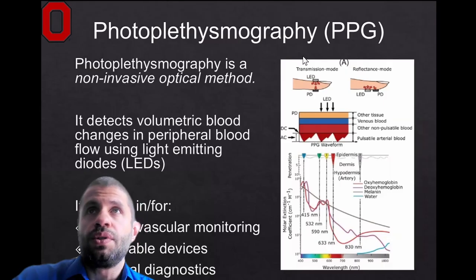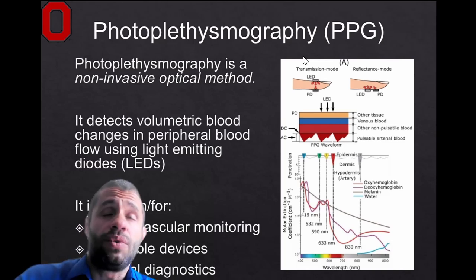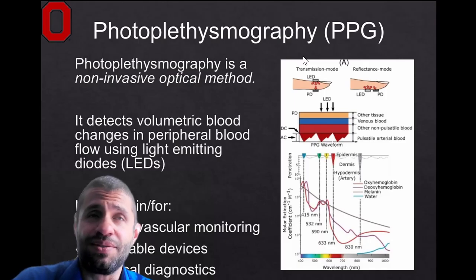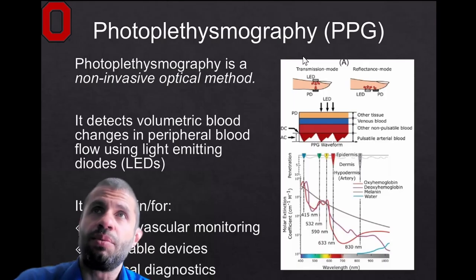You can use this, and again, we're going to explain this in a little bit more detail. We can use this to do some cardiovascular monitoring in wearable devices. I think everybody has an Apple Watch or a type of watch that has this very simple technology, I have to say, that allows for the monitoring.